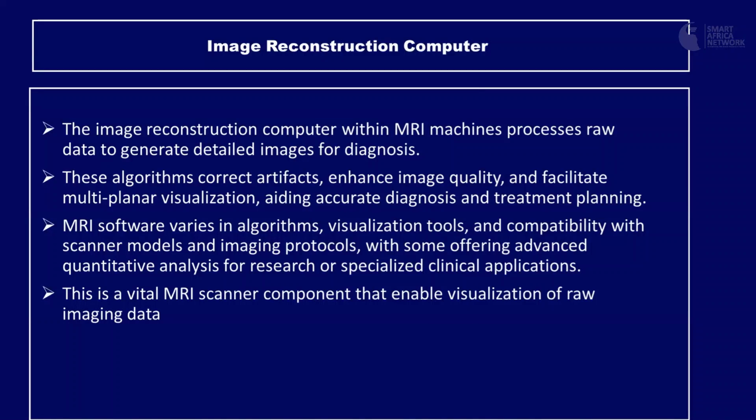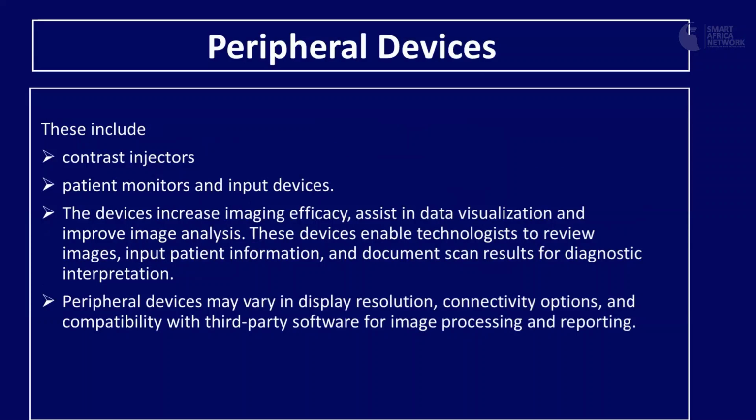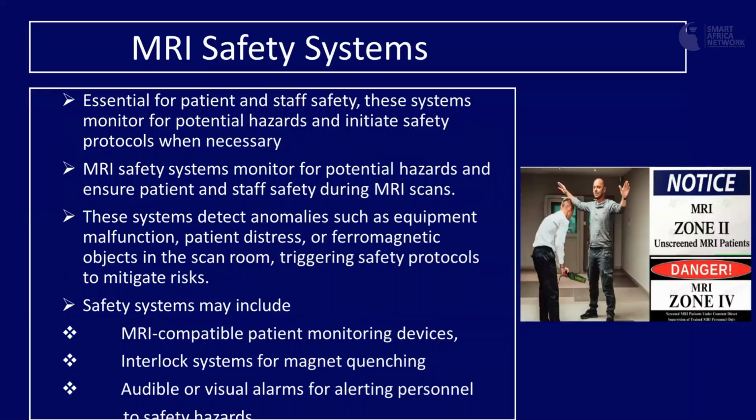And the duty is to process raw data to generate detailed images for diagnosis. And then we talk about the other peripheral devices, such as the pump injectors, the patient monitors, input devices, contrast injectors, associated with the MR machine.